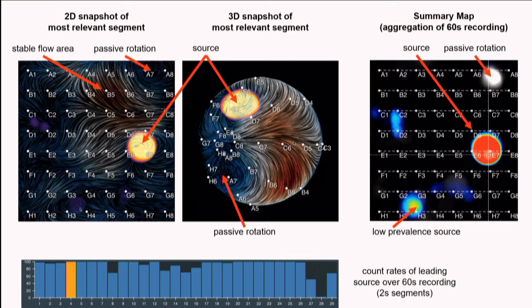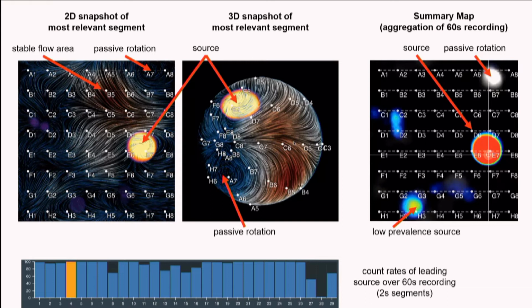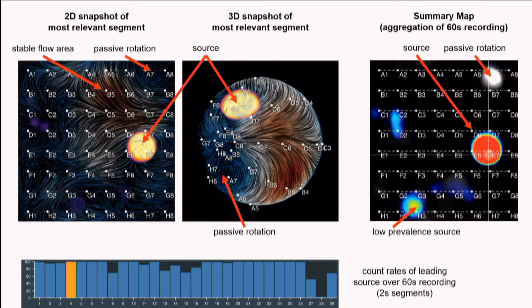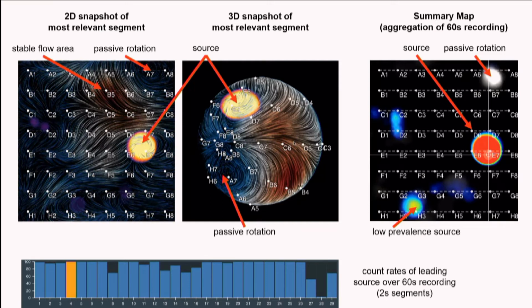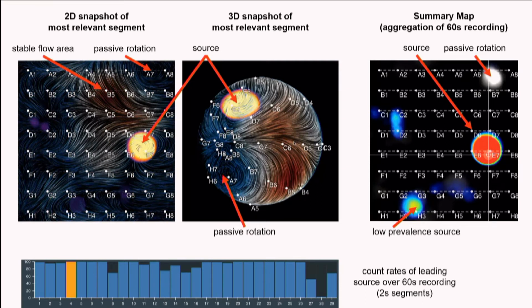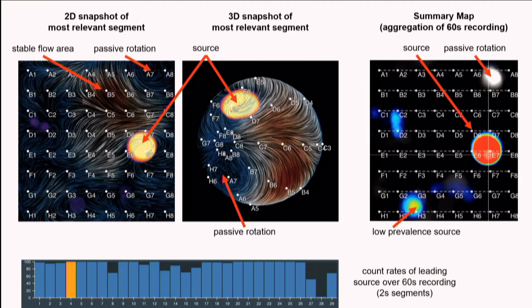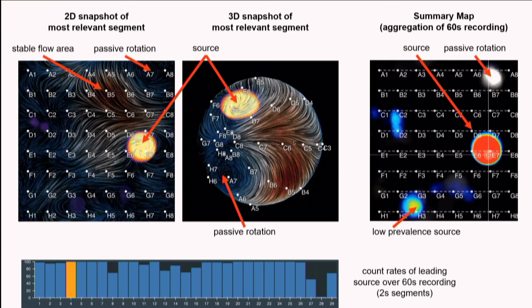So this is what we're going to see. On the left, you see a 2D snapshot, which is again a 2-second window. The middle is the same thing, just shown as if it's a full sphere as opposed to splaying it out flat. And on the far right is a summary map, and again, that's a summary of all the 2-second windows over the course of a minute. So in that, for example, the big red dot represents an area that the software says is a source, because it's there more than 26.5% of the time. And that seems to be the number that's relevant in terms of identifying a true source.